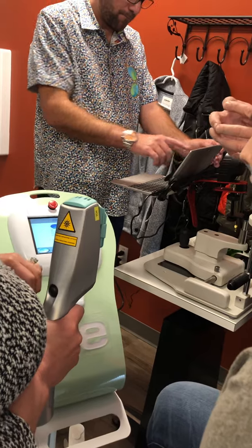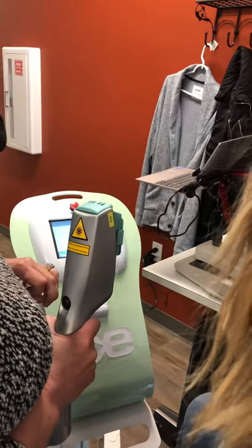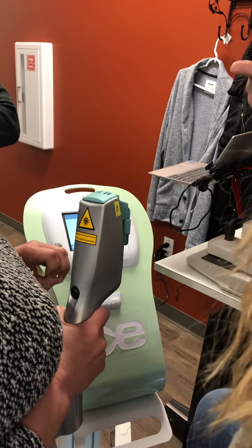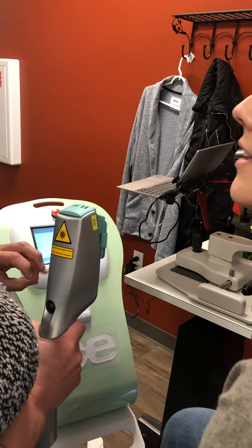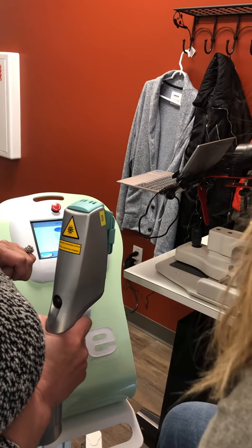It's a little out of scope, because what we're doing is we're treating for dry eye. So when we treat dry eye, we treat here and we treat here. And I don't know that you have this, but I've been looking at you since I walked in. Your cheeks are a little redder. You may have a little bit of rosacea. Okay? So what we do in that case is we treat further down.